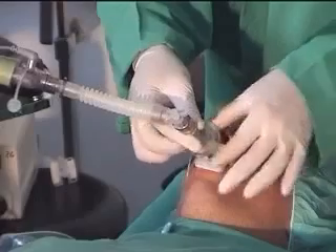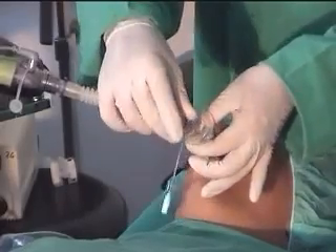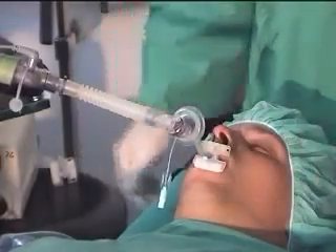Connect the breathing circuit from the mask to the endotracheal tube.